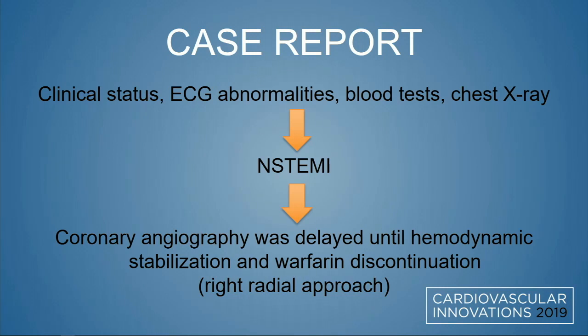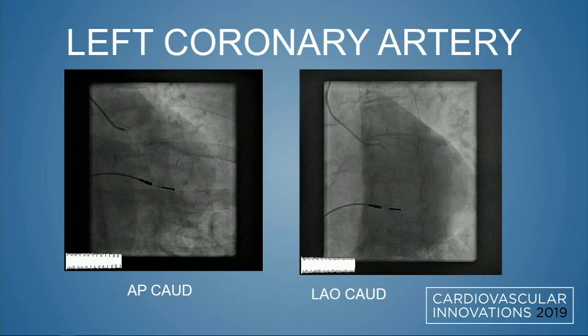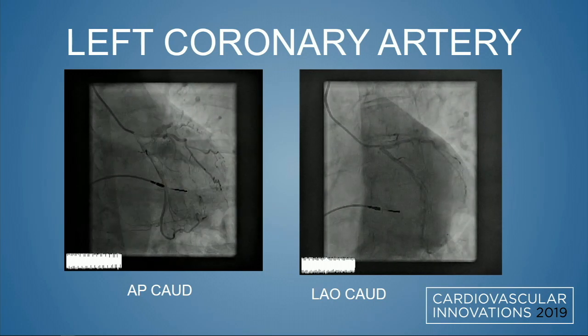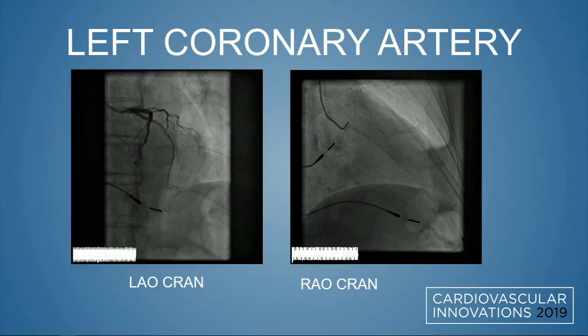We decided to perform a coronary angiography. However, the procedure was postponed until hemodynamic stabilization and warfarin discontinuation. The procedure was performed via right radial approach. Coronary angiography did not reveal any significant stenotic lesion in the left side of the coronary tree.